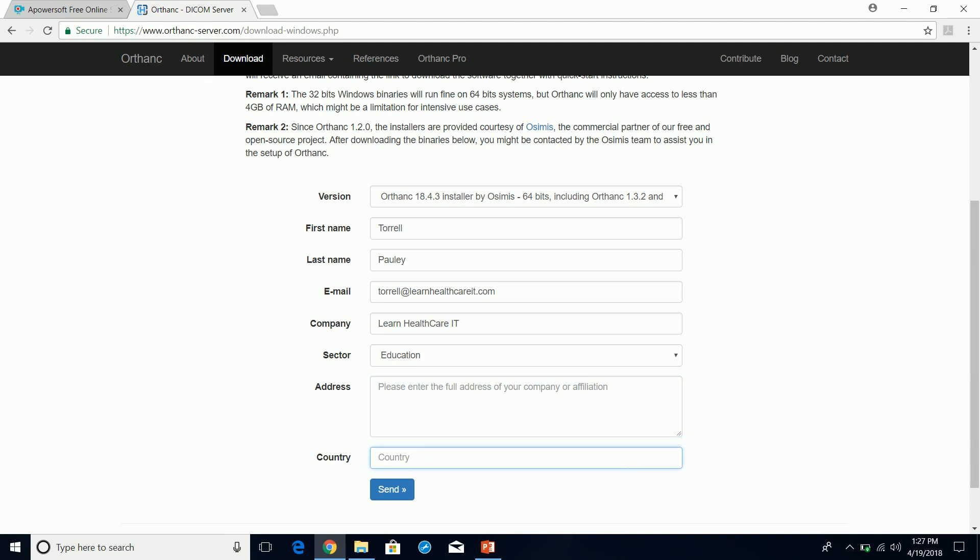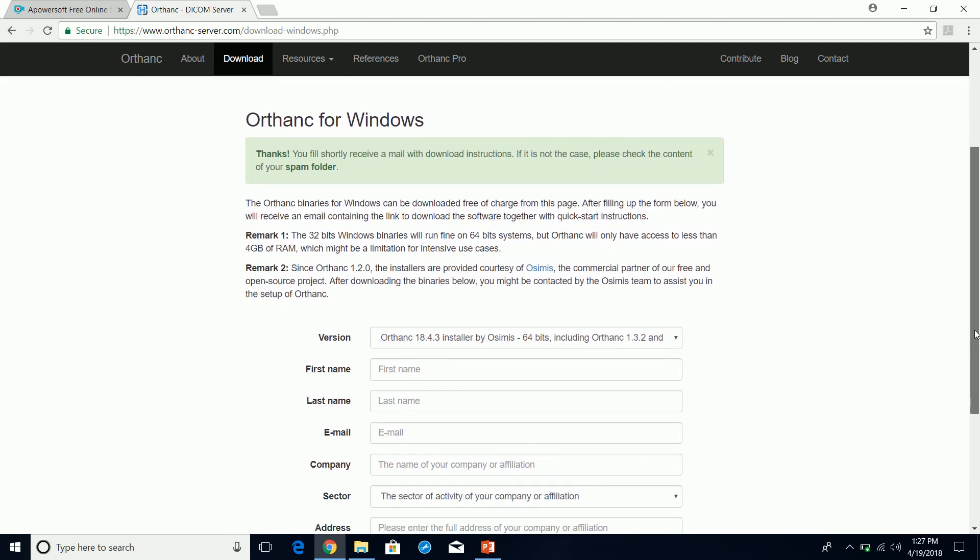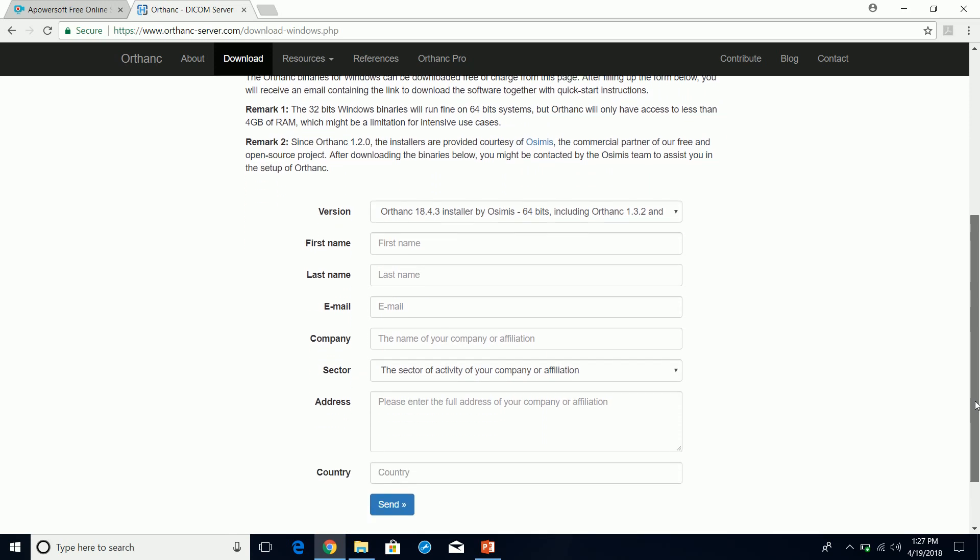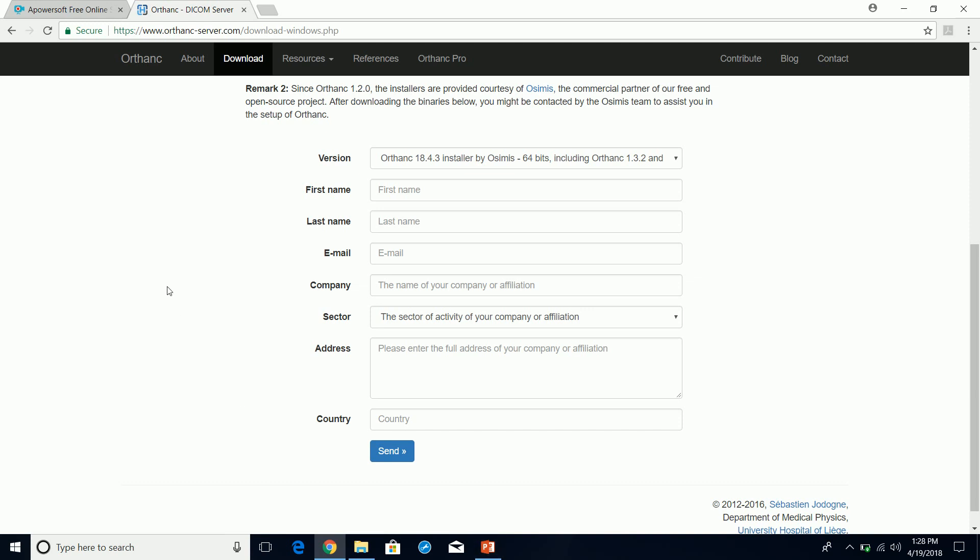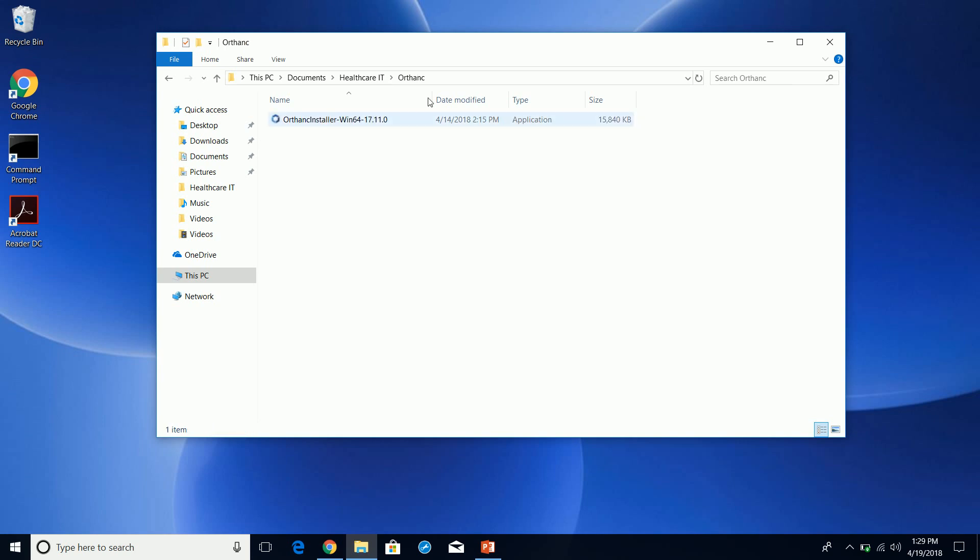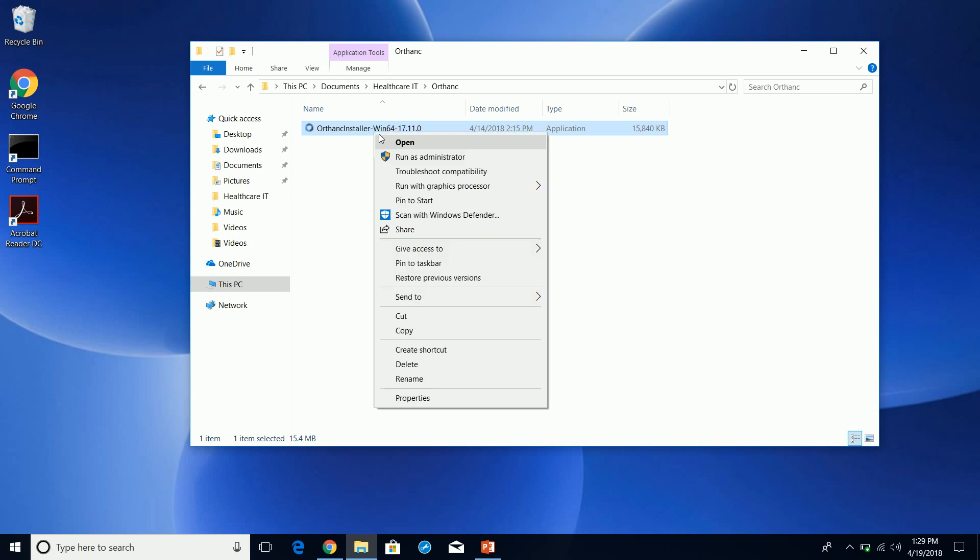I'm going to just go to my email and download the executable, so just bear with me here. Now I have the executable downloaded, the Orthanc executable downloaded here, and I'm going to go ahead and do a go through the install.